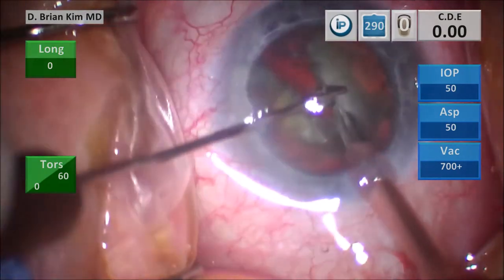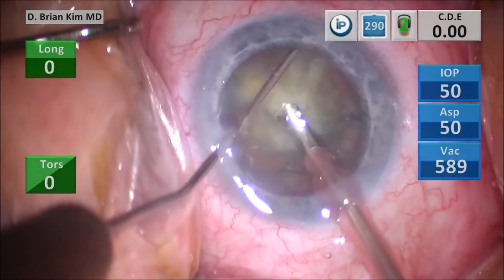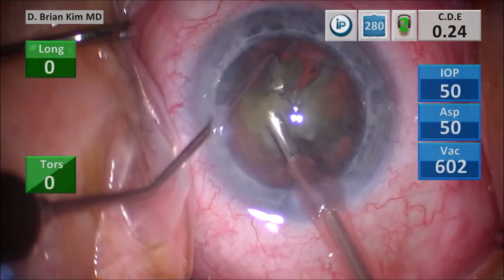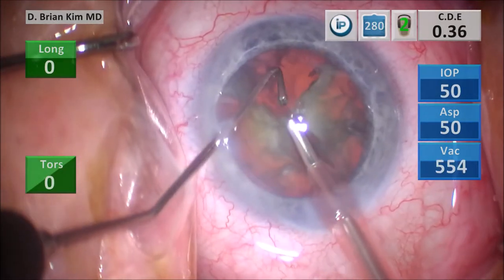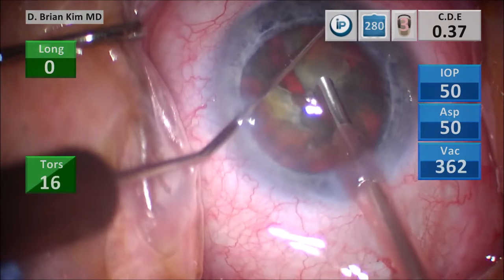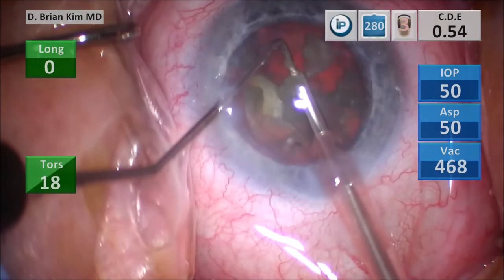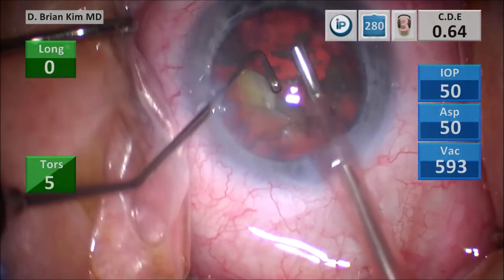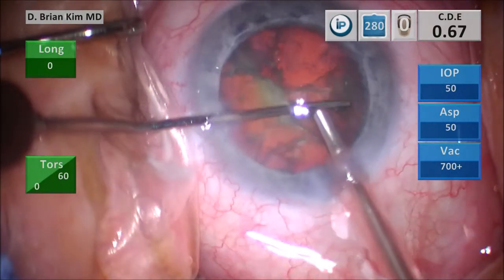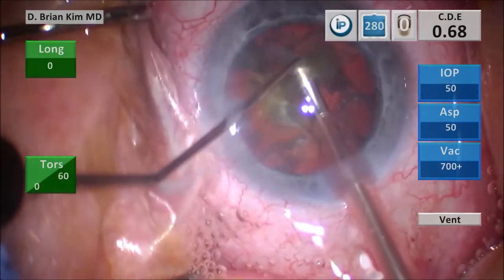Placing the chopper around the right heminucleus, around the equator, pulling it centrally towards the phaco tip, dividing that right heminucleus — that is a cross chop. Using a little bit of vacuum to lift that first quadrant up, getting around it with the chopper, crushing it and dividing it into smaller pieces, then emulsifying. Placing the chopper around the second quadrant, pulling it centrally with another cross chop maneuver, then emulsifying once they're small enough. I tried to get around that last piece of the second quadrant, but I decided to tease it off, separate it from the rest, and then emulsify the lens piece.